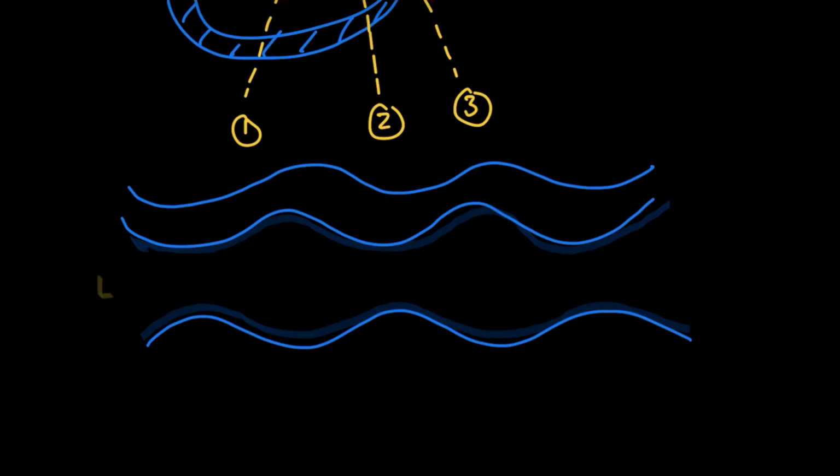Let's go back to our pen here. This is the left ventricle, this cavity. Over here, this is actually the right ventricle, this cavity here. So left ventricle, right ventricle. And you are looking at the posterior wall of the left ventricle here, and you're looking at the septum right there. You'll notice that both walls of the left ventricle are thicker than that of the right ventricle.